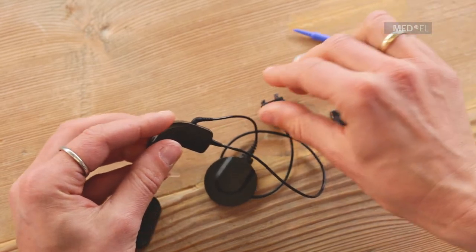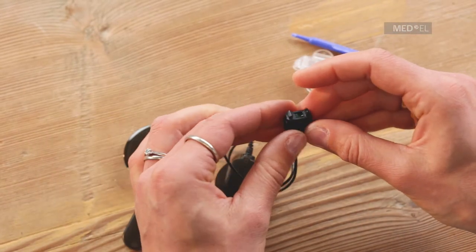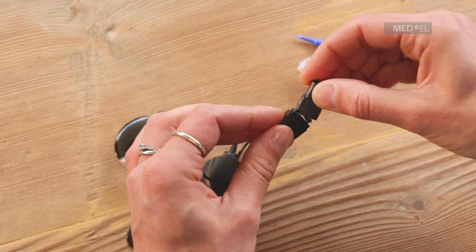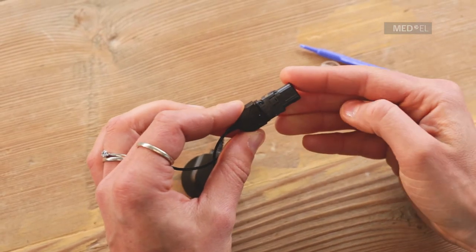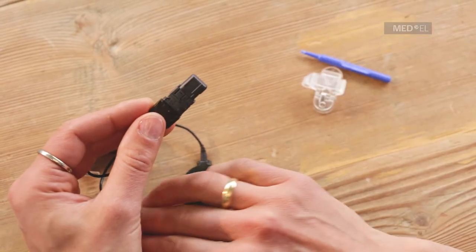Attach the rechargeable battery to the other end of the cable by inserting the hook on the cable connector into the matching groove on the battery. Push together until the release lever engages.